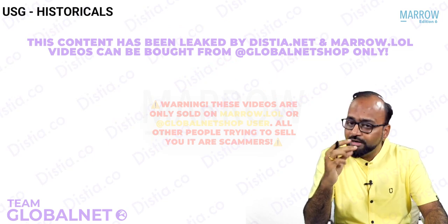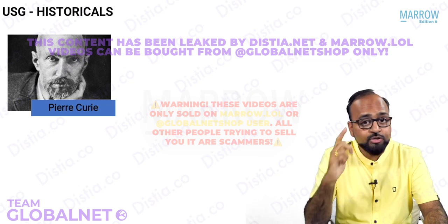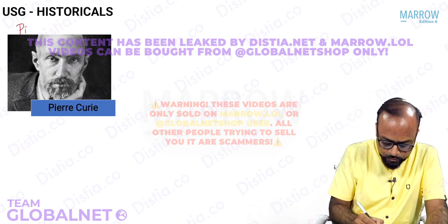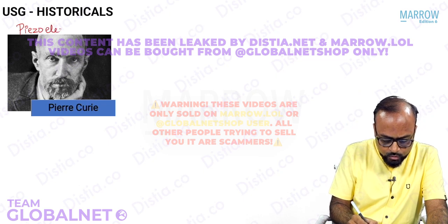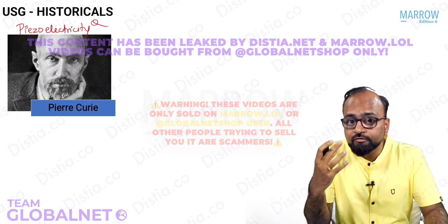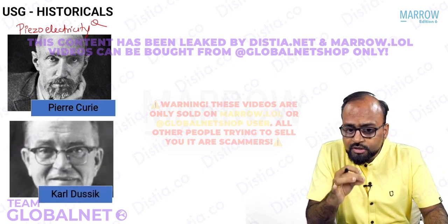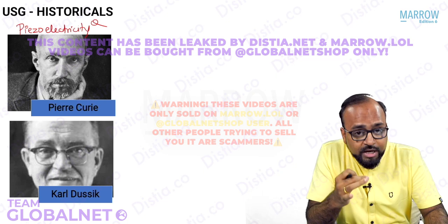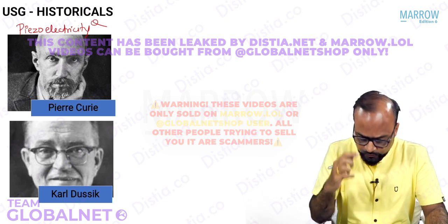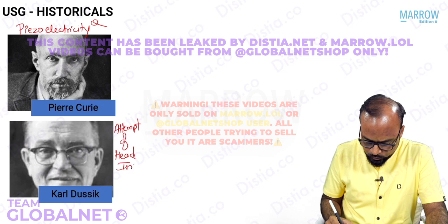Okay. So let us quickly discuss a few historicals. Remember, it was Pierre Curie who actually discovered the property of piezoelectricity. The piezoelectric effect is the basis of ultrasound, and this was discovered by Pierre Curie. It was Karl Dussik who actually attempted USG imaging of the head for the first time. So he was the one who made an attempt of head imaging by using the technique of USG.